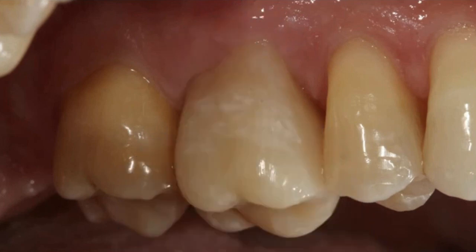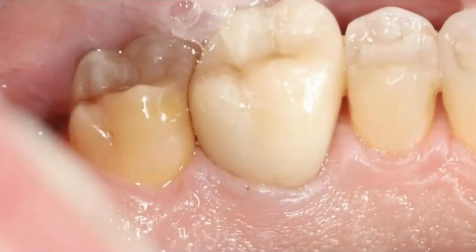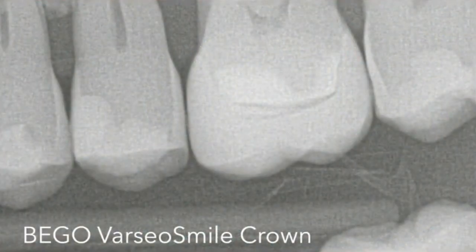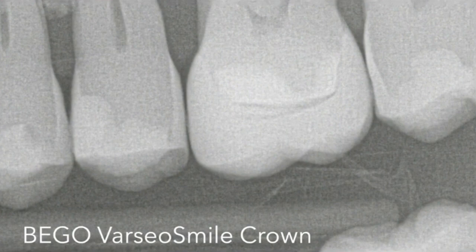But again, the point here is if you see the margin of that tooth, it's just beautiful. From the lingual view, it looks great. And the best thing is the seal. In this case, I used the 3M product, adhesive and cement, to bond this restoration.